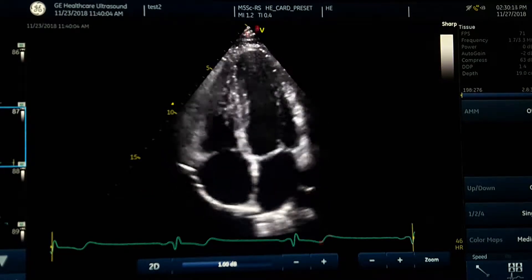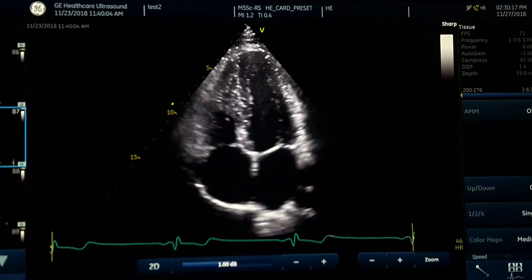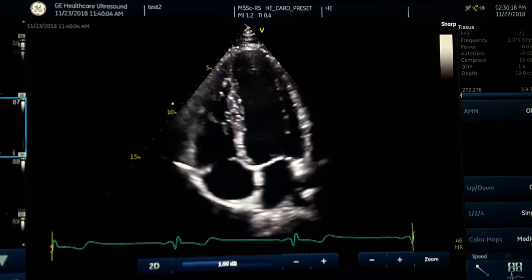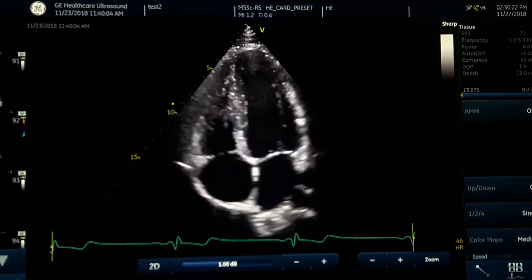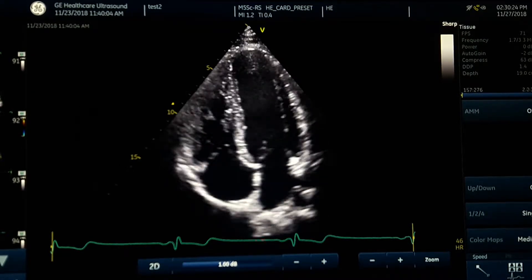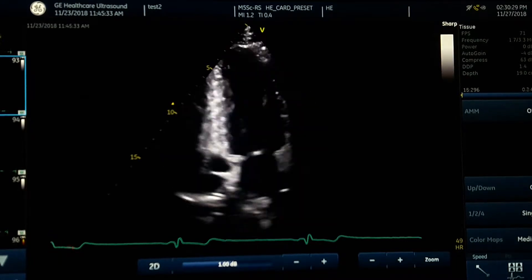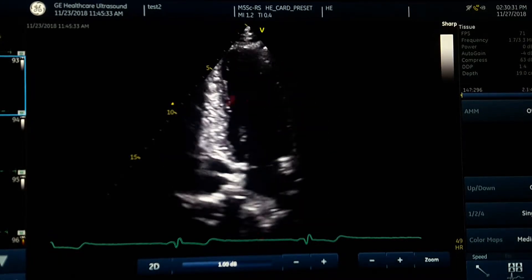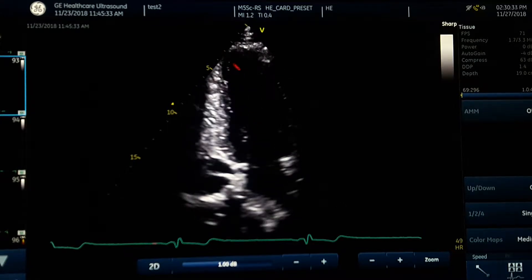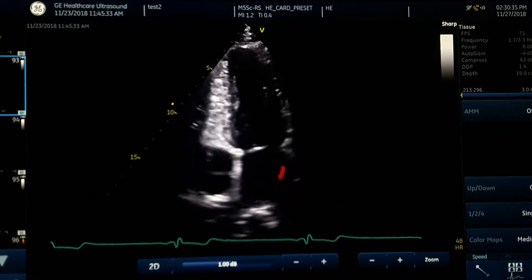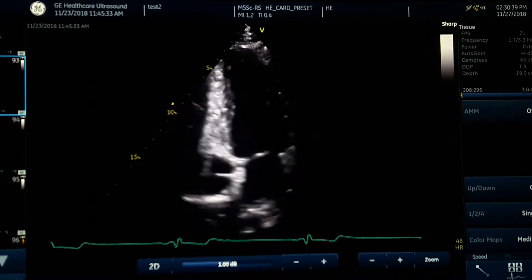The septum comes to the center of the image. In that case we are twisting the probe — somewhere between 60, 80, or 90 degrees, depending on body habitus and orientation. You can see a nicely crescent shape, a pinpoint apex, the left atrium open, and the anterior wall and posterior wall.